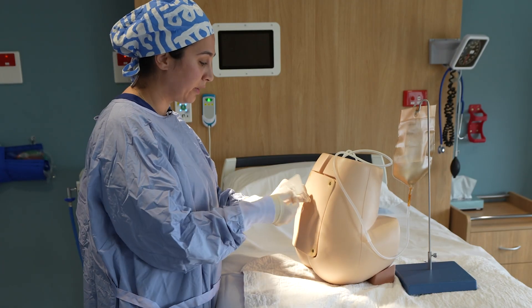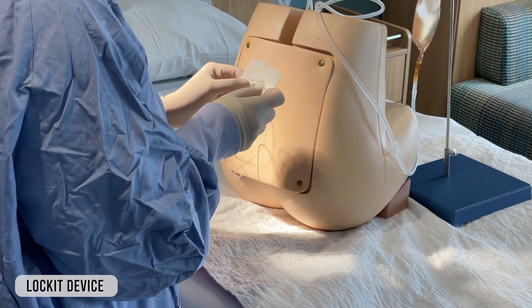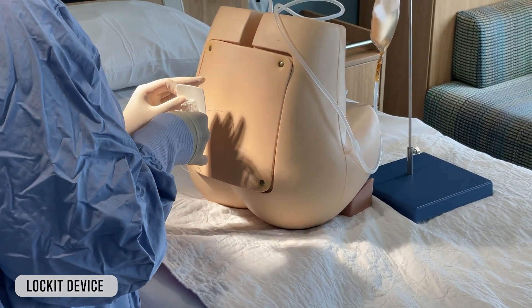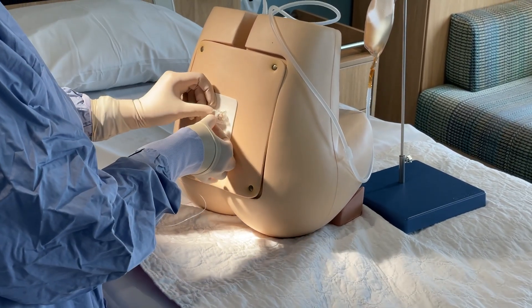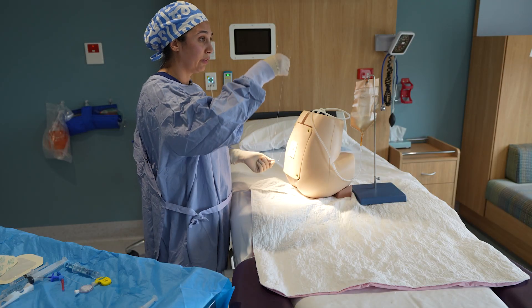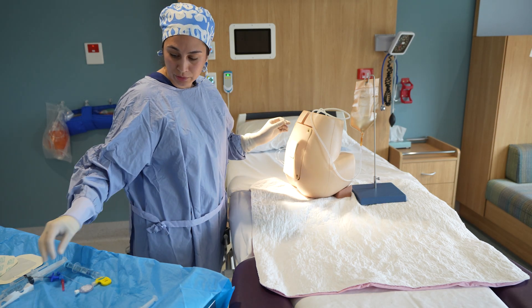At Western, we use fixation devices which help keep the epidural from dislodging. Apply the fixation device to dry skin at this point, then pull back your catheter to the desired depth — in this case, eight and a half centimeters. Then check for a falling meniscus, which is a reassuring sign that you're in a negative pressure space.